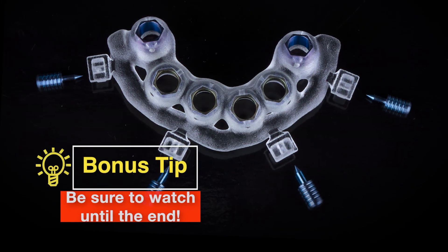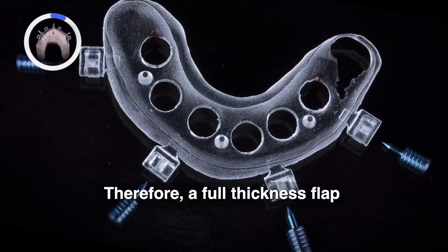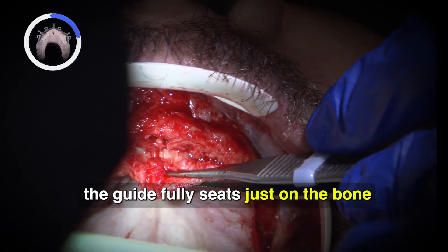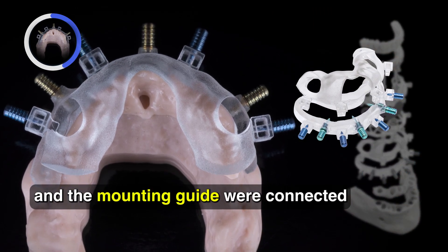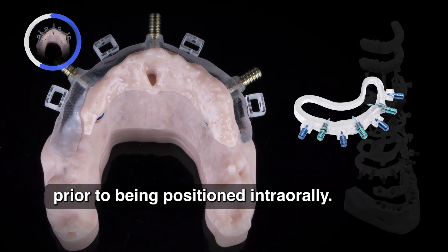This multi-level surgical guide is designed to sit directly on the bone. Therefore, a full thickness flap was reflected, extending the flap to ensure the guide fully seats on the bone and no tissue interferes. Next, the foundation guide and the mounting guide were connected with the blue interlocking pins prior to being positioned intraorally.